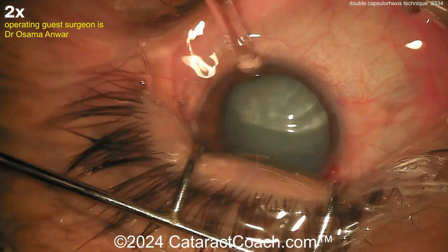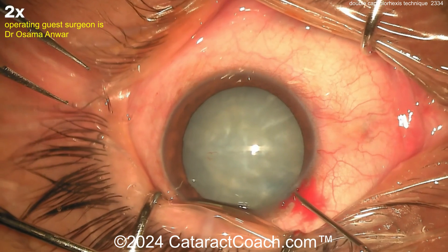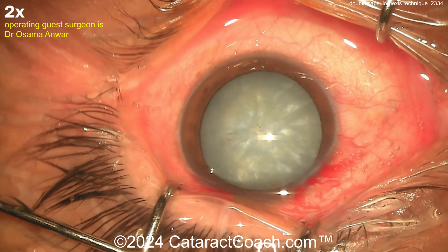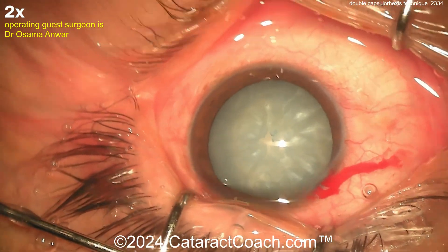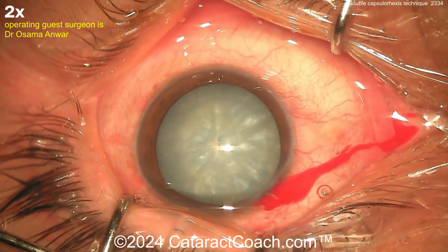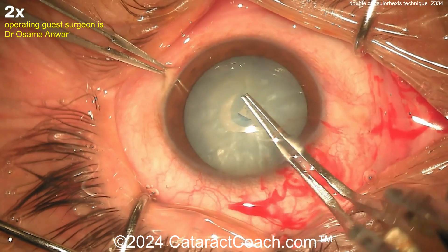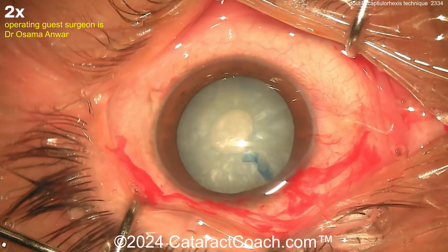Here comes the viscoelastic. Now the double rhexis technique means first creating a small rhexis. I tend to like to go in through a paracentesis and first decompress that way, but you can do it like this. Once that's done, you've got some leakage of the liquefied lens milk. More viscoelastic going inside the eye — let's get that first baby rhexis done post-haste. You want that small rhexis done because a rhexis has an advantage: there are no edges that can run out. So as long as it's somewhat round or curvilinear, it doesn't really matter the exact shape — and you can see how it wants to run out unevenly.